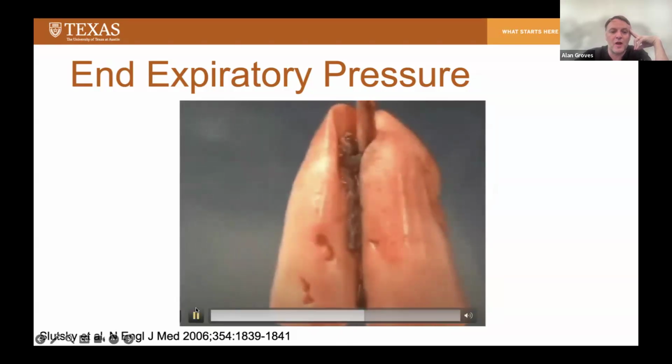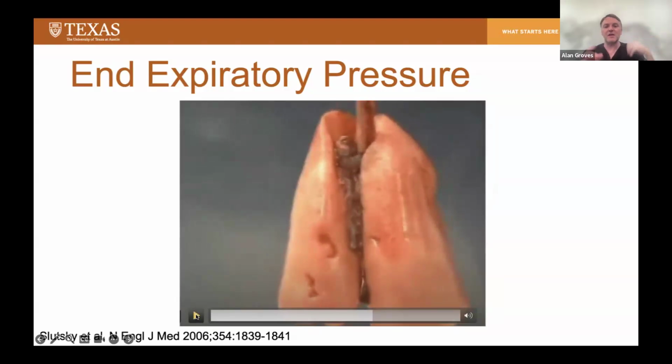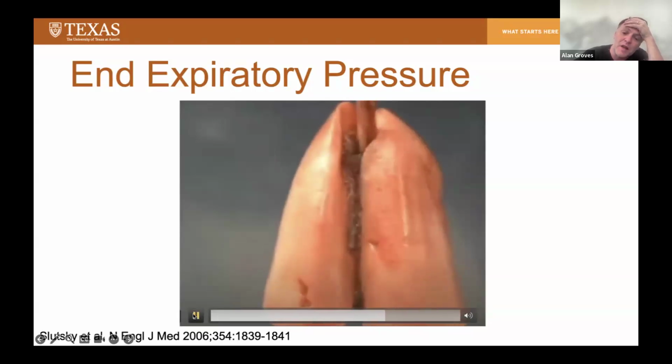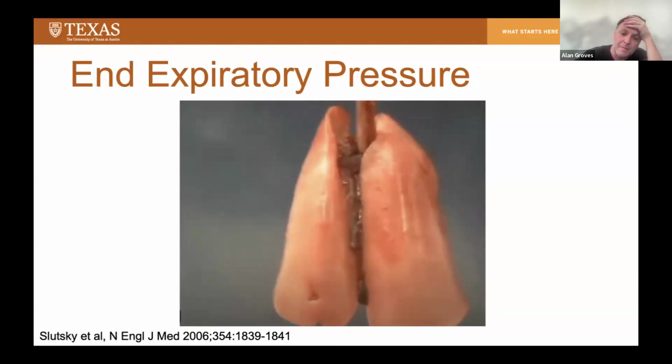So the other thing I want to try and point out in these images is clearly this lung expansion looks vastly better. But I do also want to point out, even with this glorious lung inflation all the way through, there are still these stubborn parts that haven't fully opened up. And it takes a long time and PIP and PEEP and time to get to full lung recruitment.